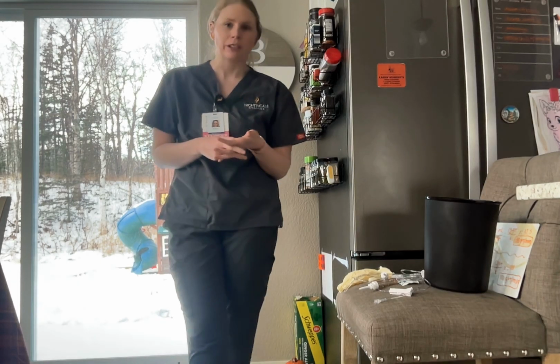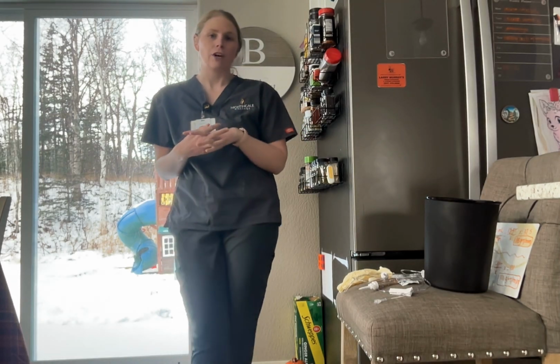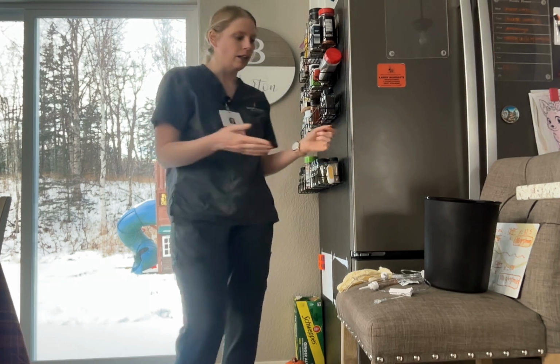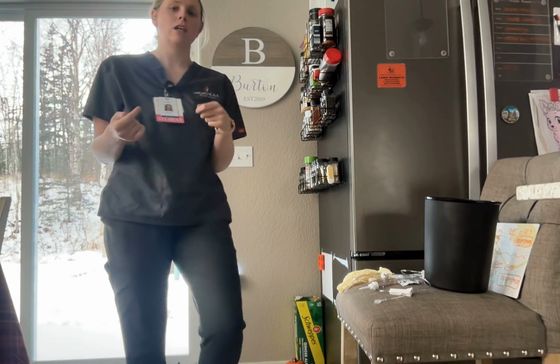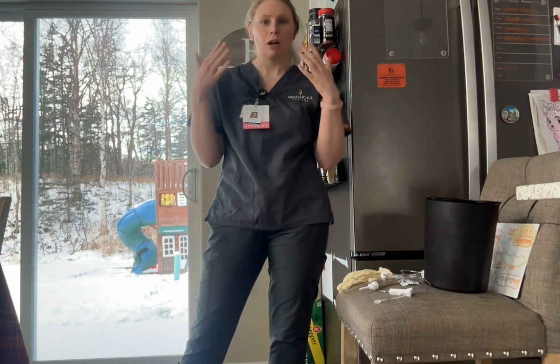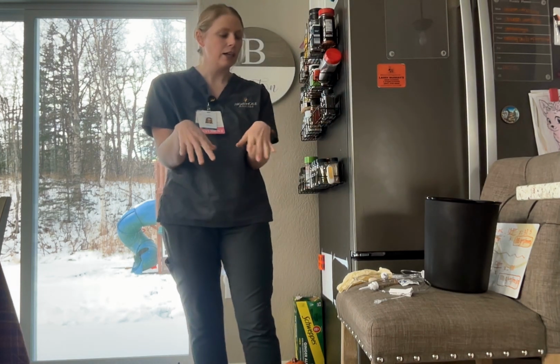Hi, my name is Maggie Burton, and this is my remediation skills video for establishing an IV, the primary and secondary fluids and medication. We have all our necessary equipment. We have our badge, uniform, hair is pulled back, nails are free and clear.